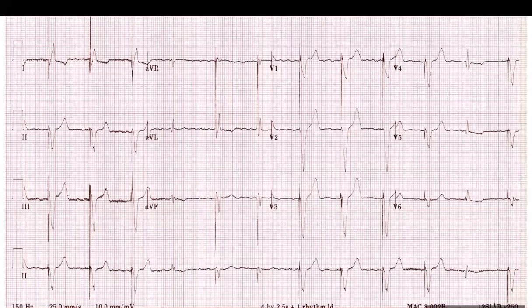So let's take lead 2. It shows a paced rhythm, the first 3 beats, and the fourth is not paced. There is no spike, and it has a different morphology. So let's start. The first 3 beats have a pacer spike. Yes, and a wide QRS. So this goes with delivery of the pacing impulse and capturing of the ventricle. So we can comment on ventricular capture, right? Yes. And there is no atrial activity. Okay.